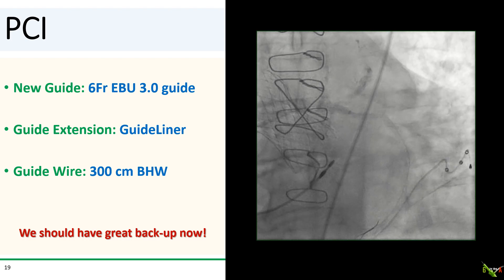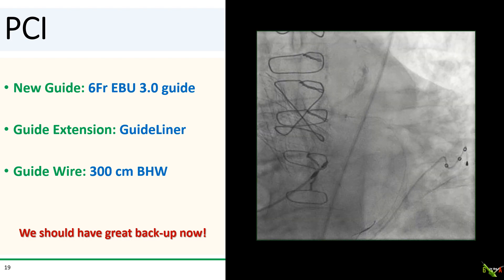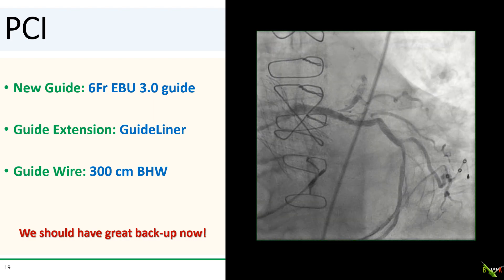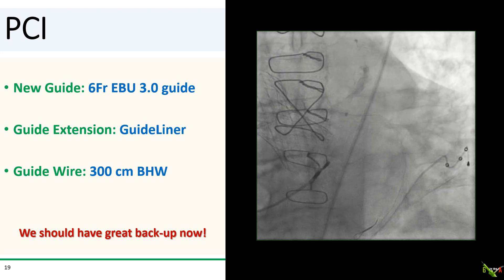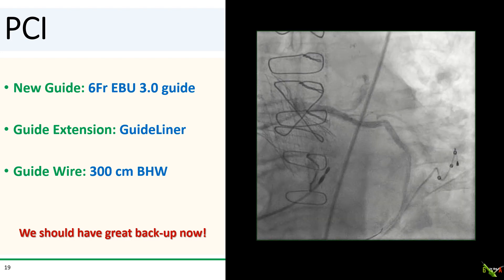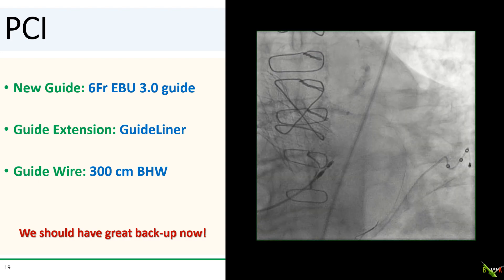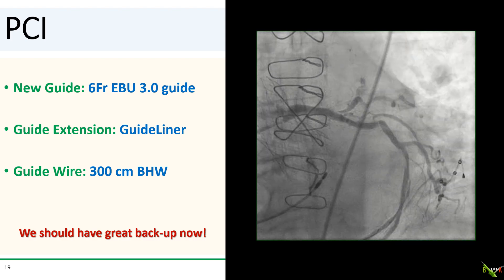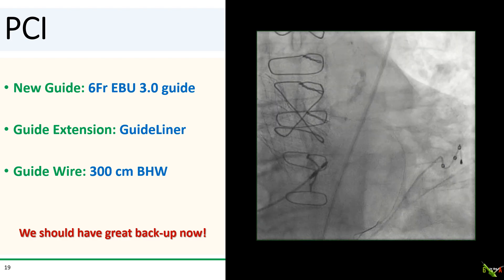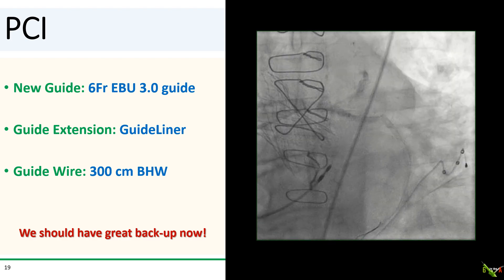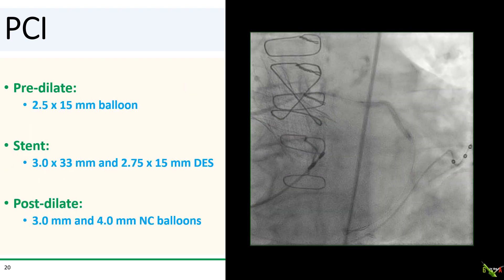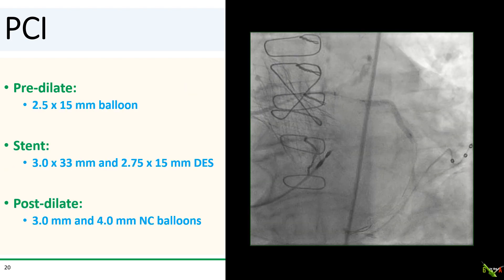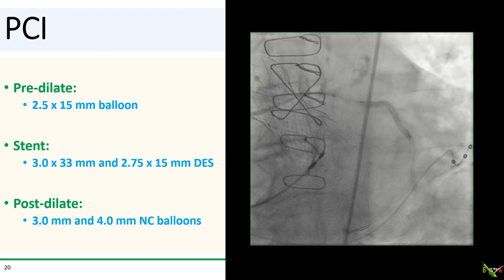We were able to successfully exchange our AL1 diagnostic catheter to a proper 6 French EBU 3.0 guide catheter, and then we inserted a guideliner to further stabilize our engagement. With good backup, the rest of the PCI became actually quite straightforward.